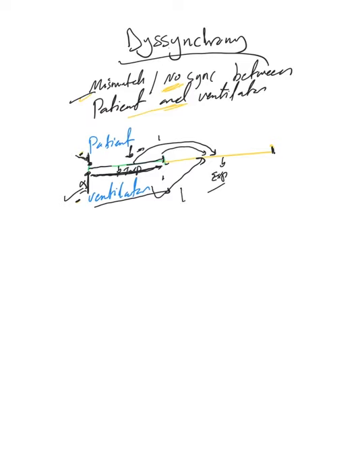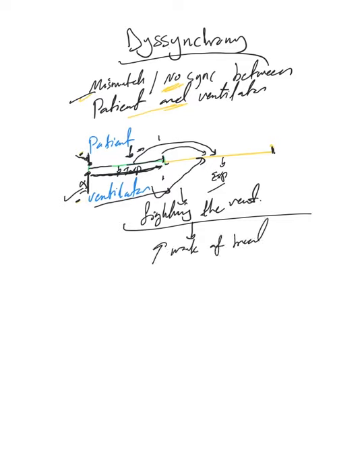And sometimes we call it fighting. The patient is fighting the vent. It's very important to recognize it and treat it, because simply this will lead to increased work of breathing. So for the patient, instead of the ventilator helping the patient, it makes things worse.